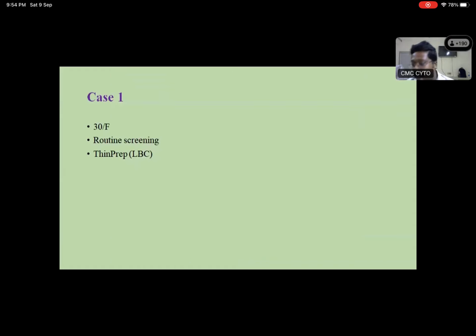First case, Dr. Sweetie is there? Dr. Sweetie, are you there? I think we lost her. Anyway, we can go to the second slide. Continue. Dr. Sajana, can you please read the history?